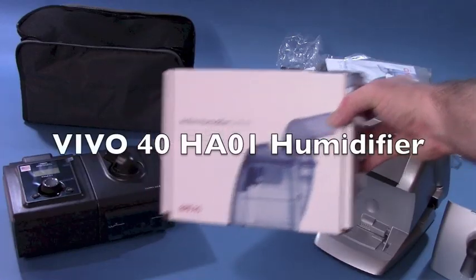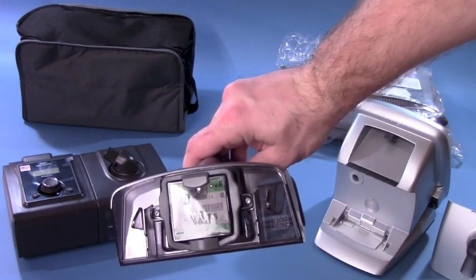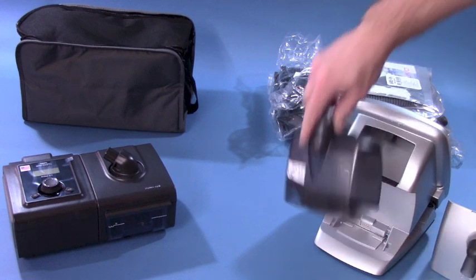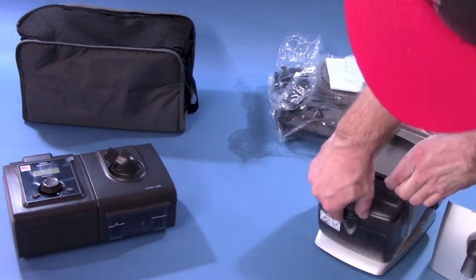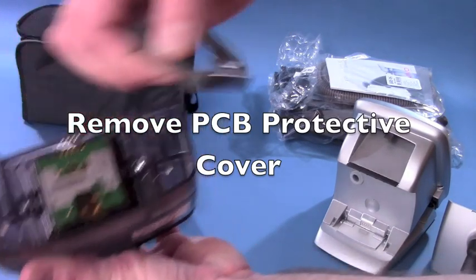Maximize the advantages of the Breas Vivo40 with the Breas HA01 active humidifier. Its integrated design eliminates the need for extra cords or more room on the nightstand. This heated humidifier is built to be easy to clean and refill, giving you one less thing to worry about in your respiratory therapy.